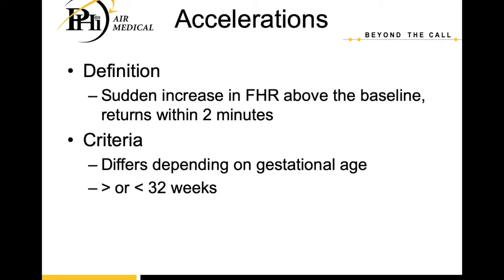All right, so we've talked about baseline, we've talked about variability, and now let's go ahead and talk about accelerations. So accelerations are defined as a sudden increase in the fetal heart rate above the baseline that returns to the baseline within 2 minutes.